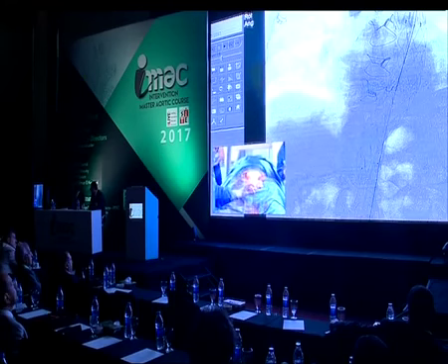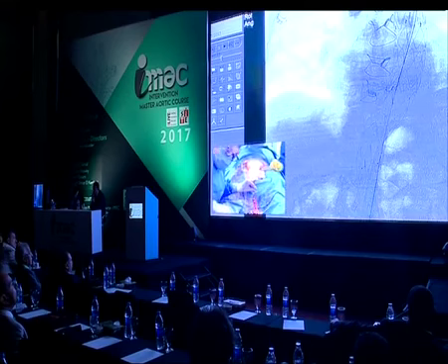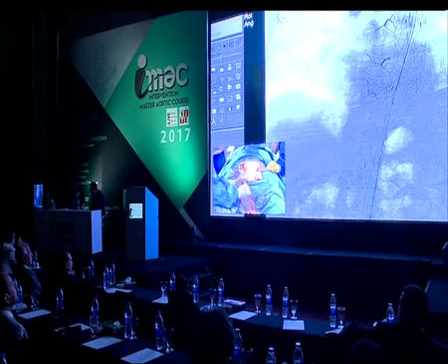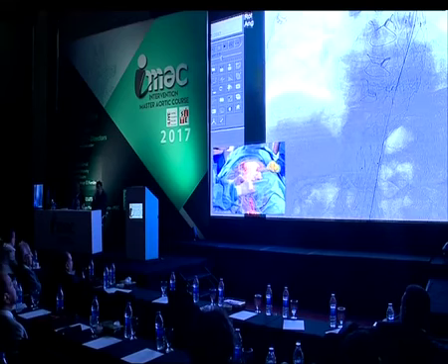We have a CSF pressure of about 22. What do you think? 22. Yeah, I think 22 centimeters of water is a bit too high.